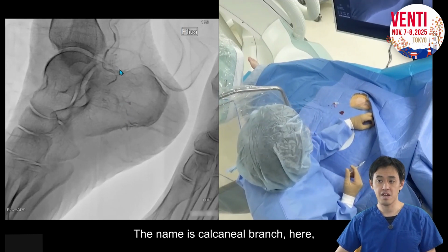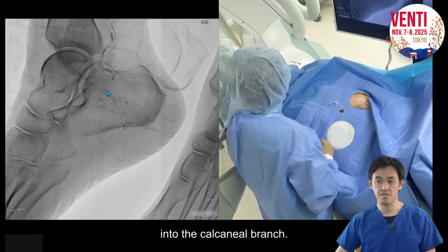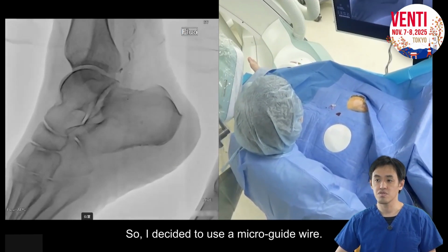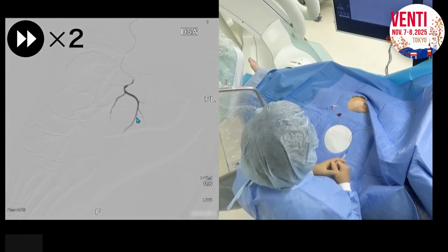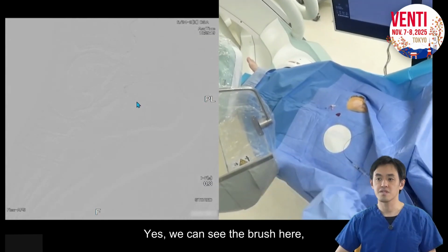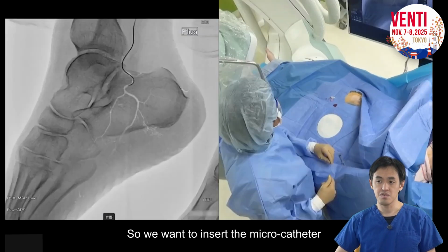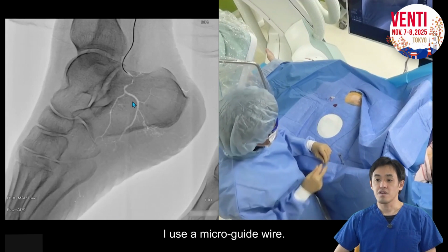The name is calcaneus branch here, so we want to insert into the calcaneus branch. But I noticed that there is some curve, so we cannot go over the curve. So I decided to use a micro guide wire. Yes, we can see the brush here, and the calcaneus branch is here. So we want to insert the microcatheter deeper into this branch. So I use the micro guide wire.